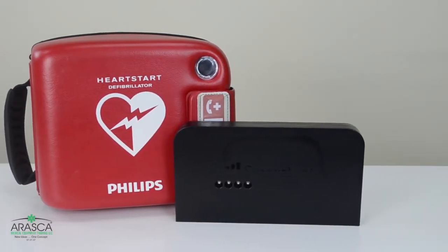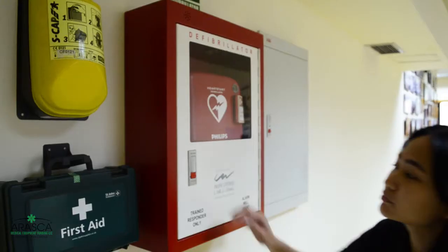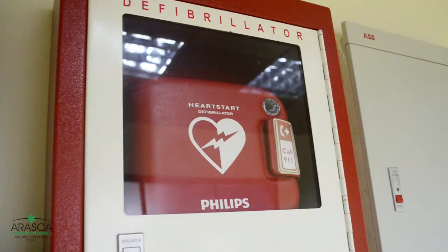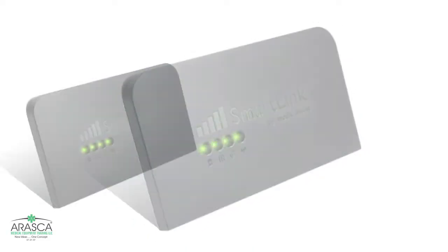SmartLink is a device that provides remote monitoring for Philips OnSite and Philips FRX AEDs. It helps eliminate manual checking of AEDs, which ensures that the AED is monitored 24/7 and maintenance is done as soon as needed. SmartLink does the job for you.